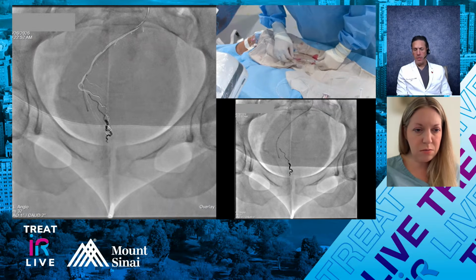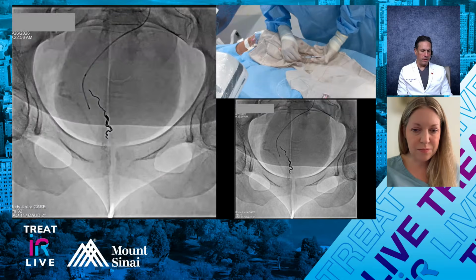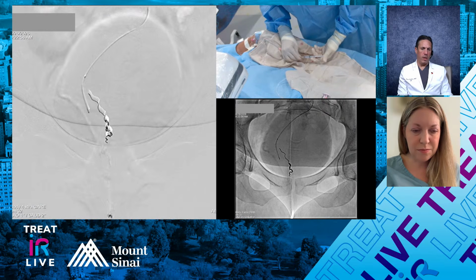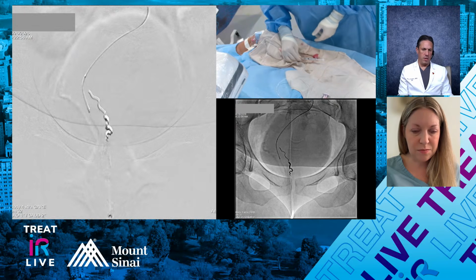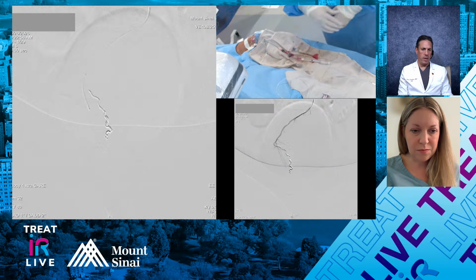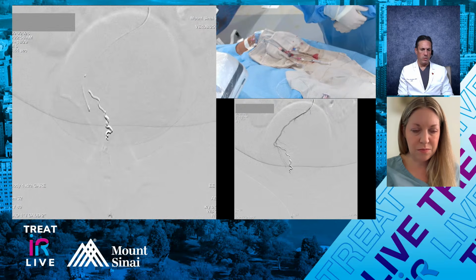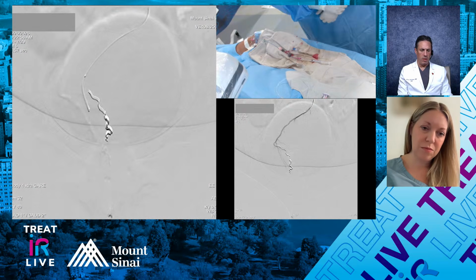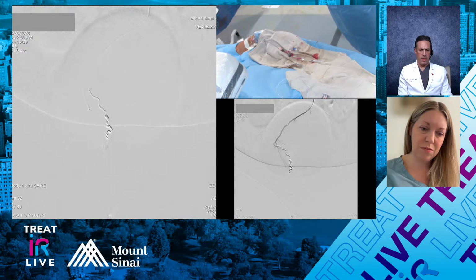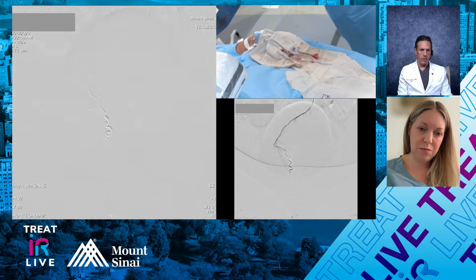Here's a theoretical question that I would love someone to help me figure out, because I don't know the answer to this. From a micron size, where do you think, in an ideal scenario, we would want this embolic to end up? Do we want it at the 100 micron level? I mean, assuming you didn't have to worry about ischemia. Is 300 too small, or do you think that's reasonable if it wasn't a particle, as an example, if it was some other type of embolic?